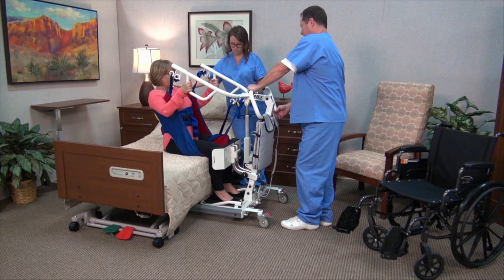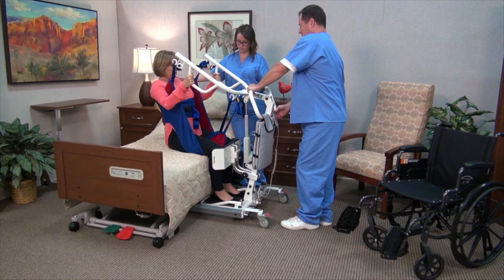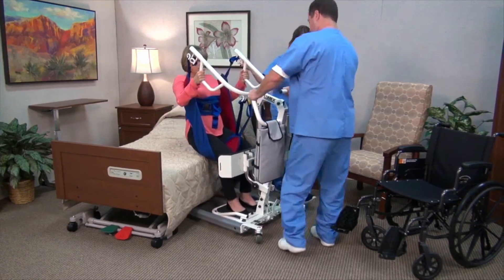With a powered lift mechanism and manual base spreader, the LF-2020 is easy to use and provides an excellent solution for transitioning from a bed or chair.